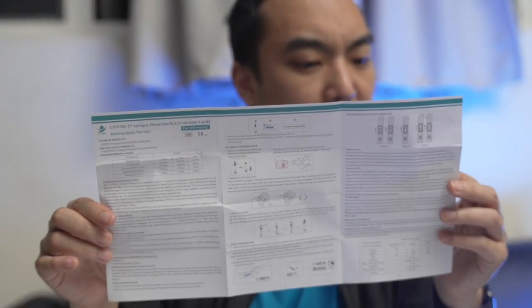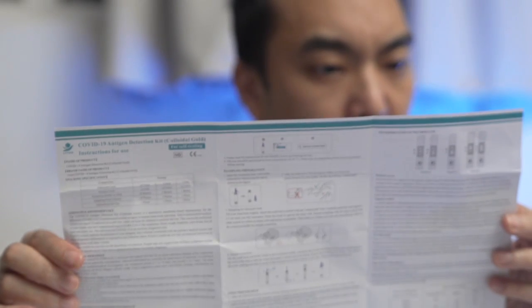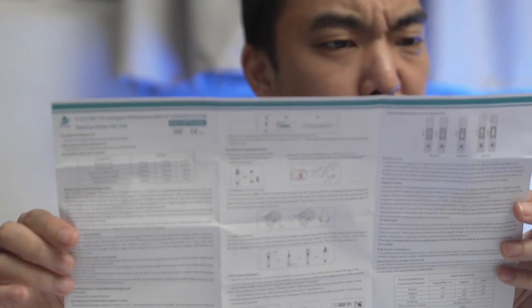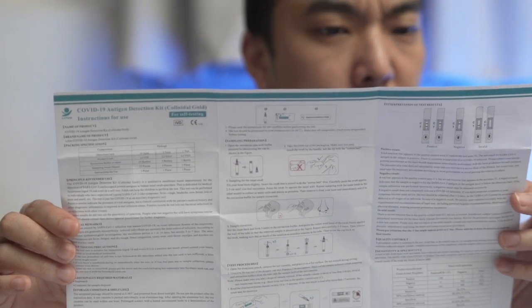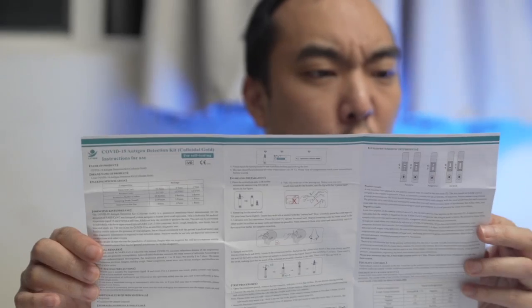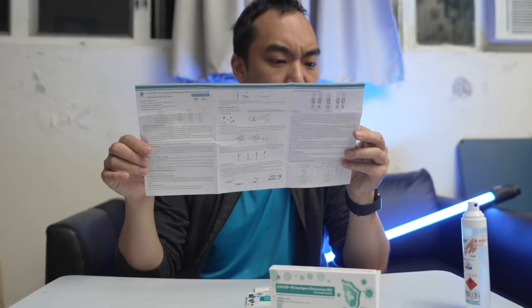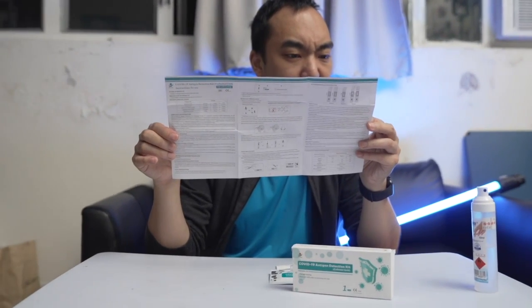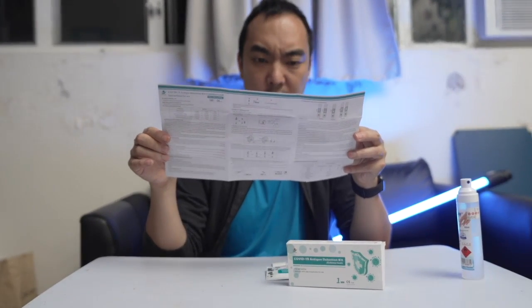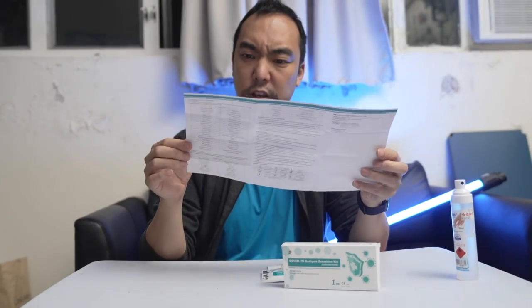other stuff like SARS, and cross-reactivity with the following organisms was investigated. Samples that tested positive for the following organisms were negative. So if you have rhinovirus or you have adenovirus, it's not going to say you have it. I think that's what it means. Anyway, this is really complicated.